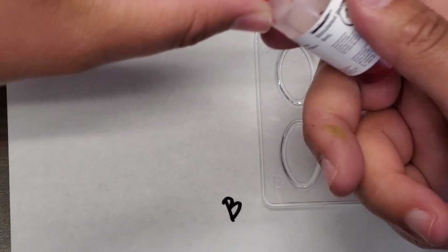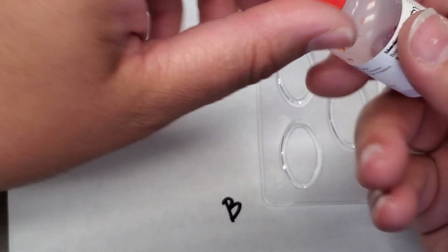So the first thing that we're going to do is take our sample of blood. This happens to be sample number 1.